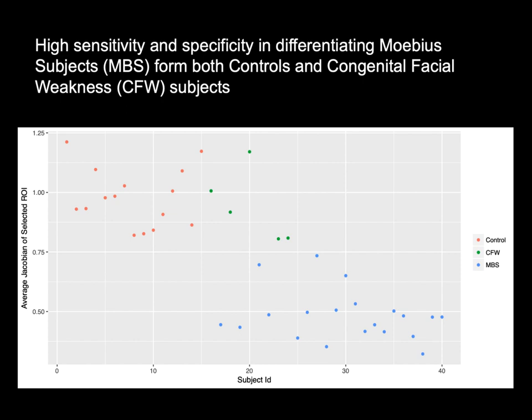If you do a tensor fitting, you could actually do error propagation and put an estimate variance to your FA, but indeed what you actually generally feed your statistical program with is the estimated value, which is your best guess, right? So you could include there are statistical programs where you can include the uncertainty as well.